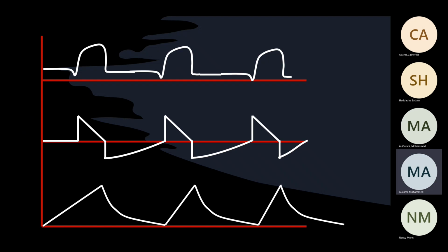So the flow is decelerating, okay, but the volume is still the same. Good. I know it's wrong, but the amount is still the same. You are right. So the flow is stable. The flow is the same. There are no changes in the flow except it's not square, and the volume is the same. But the shape looks different, and the pressure is all right. The pressure is the same, so it's constant. So what do you think then?